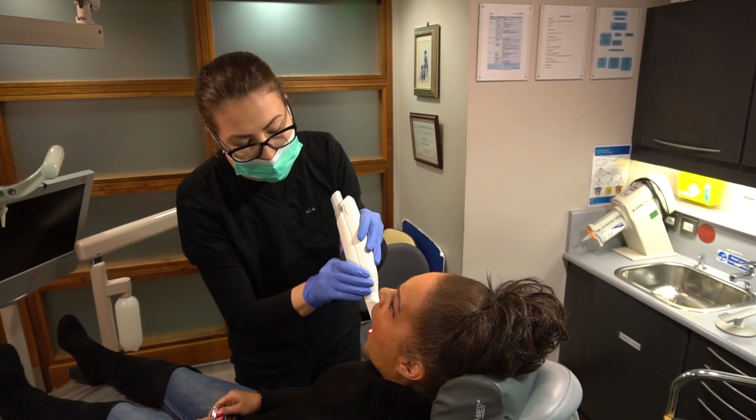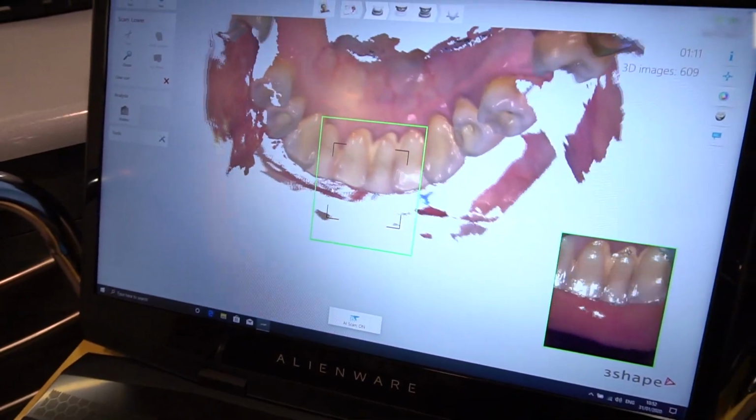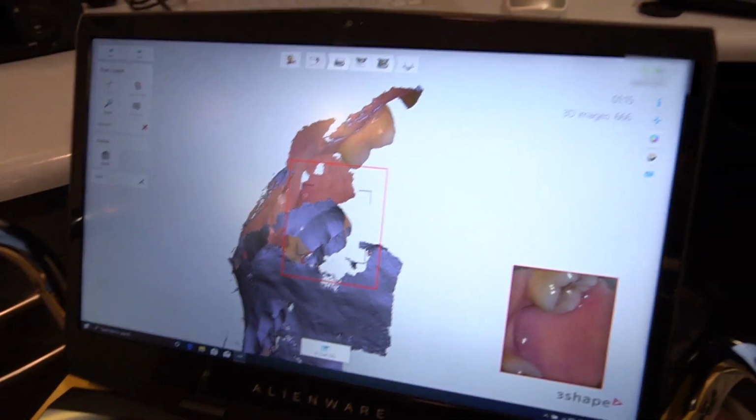At one of the practices I work at, we've got a pretty cool machine, and it's like a little camera on a stick, and it's a 3D scanner. So we eliminate taking molds in a lot of cases, and we just do a 3D scan of your teeth. And this is pretty cool because this can just be emailed to the guys who make the guide.